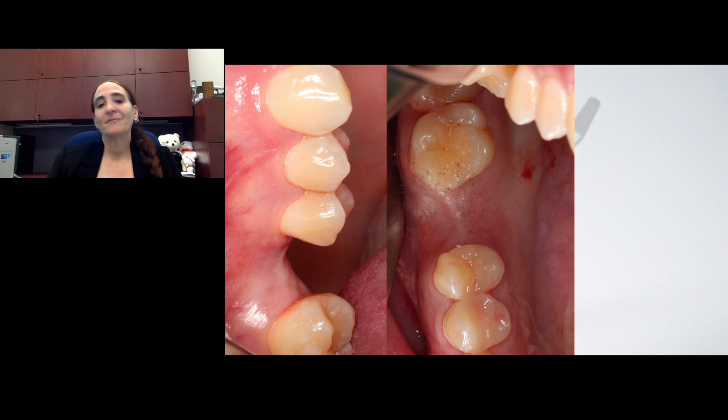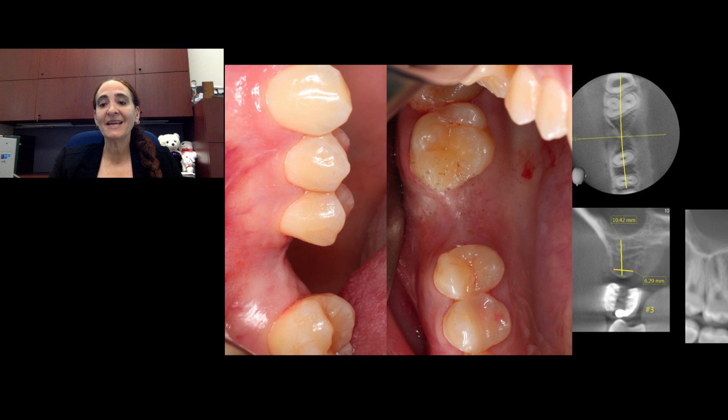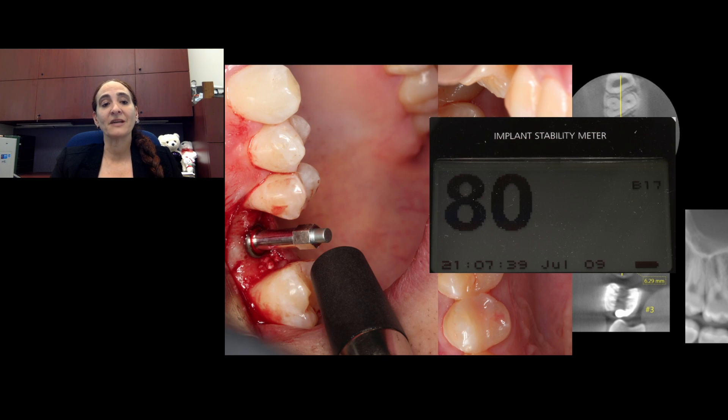This is a specific case of a patient who is missing a molar and we are going to place an implant. This is a healed site — you can see here that it's the upper right first molar. We have adequate amount of bone, both decent width and height, and we aren't going to need to do any kind of sinus elevation. We're just going to place an implant traditionally.